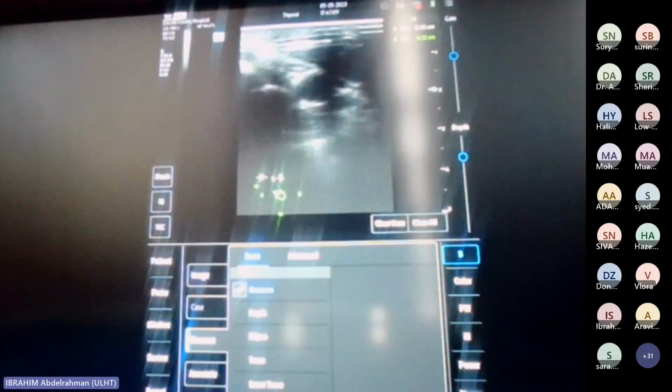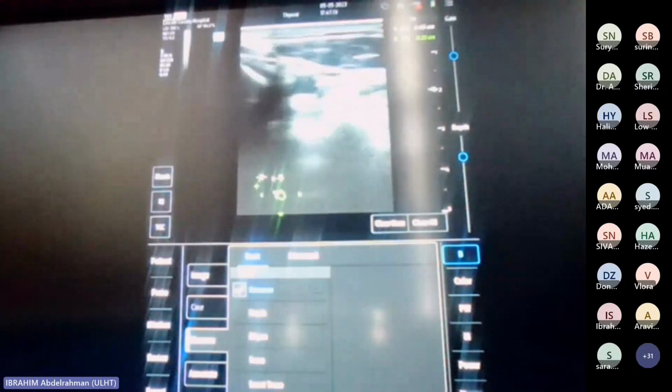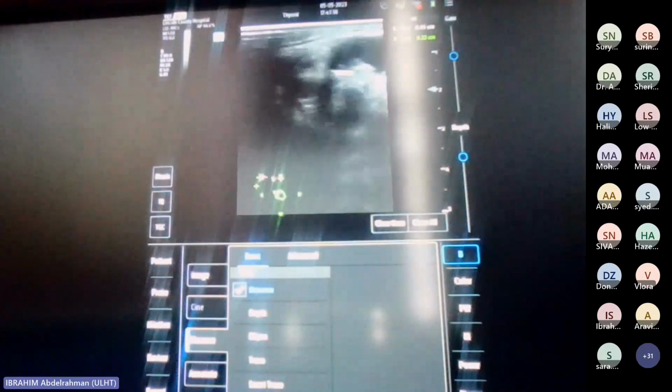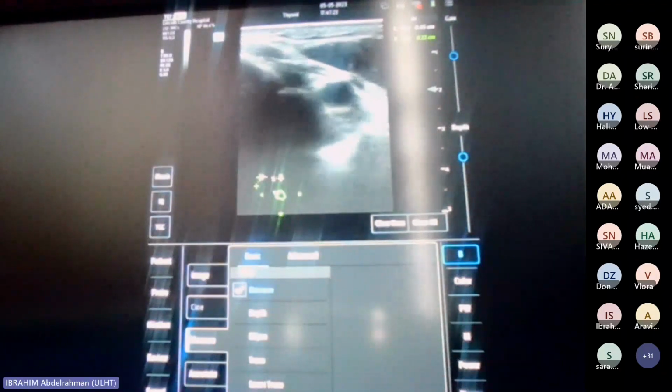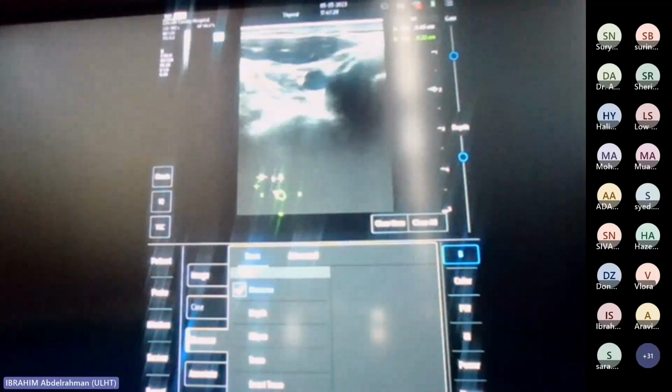Right, so yeah, that's really nice. So there's the carotid, just move your approach away a little bit. So common carotid, internal jugular vein, just bounce on that a little bit. See how when you push on that, if you look to the other screen and get it right here, you can see the vagus nerve really nicely. Yep, so there's the vagus nerve.